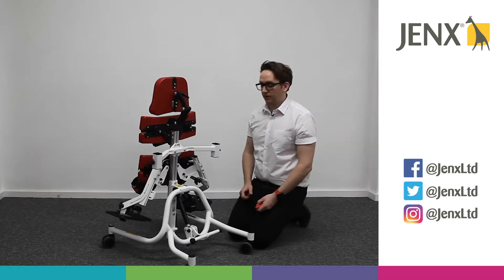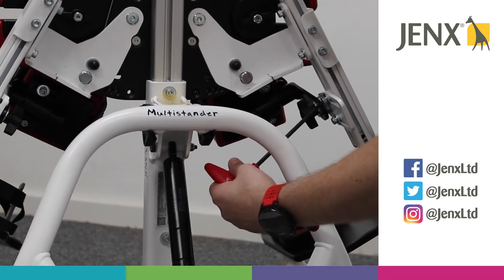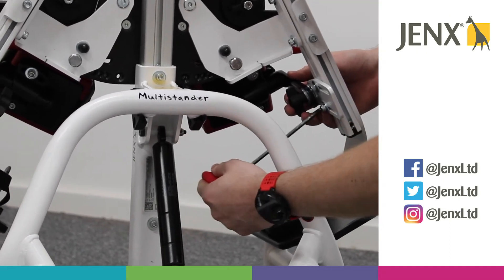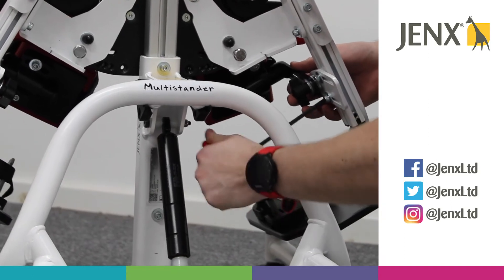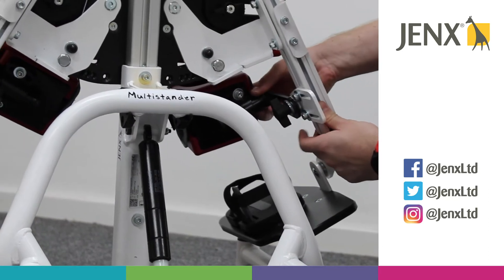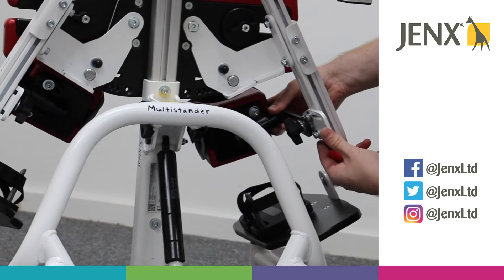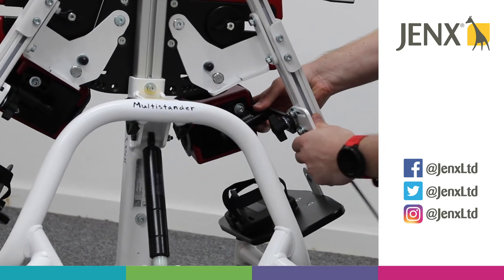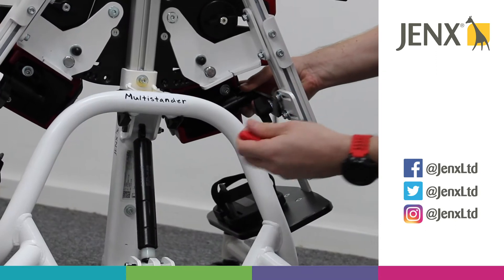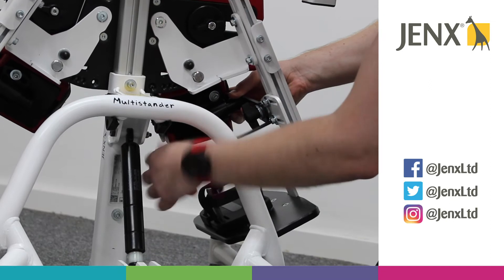If we need to adjust the knee cups on the abduction plate, we have a couple of adjustments we can do. If we loosen the two allen keys at the back, that will allow us to move the whole knee cup forward and back so we can adjust for any flexion. We can also move the knee cup up and down. Once we've found the position that we want, we can tighten those back up.